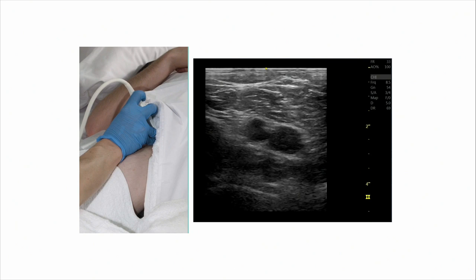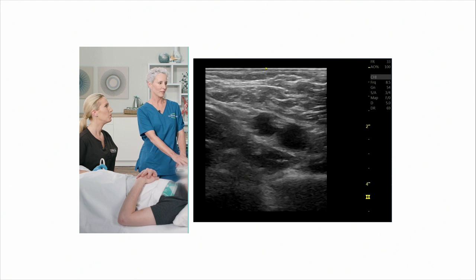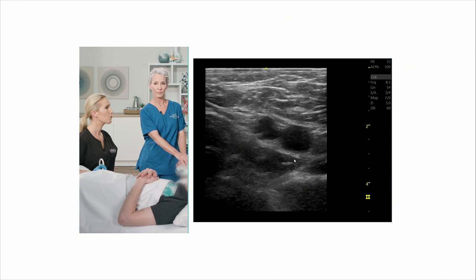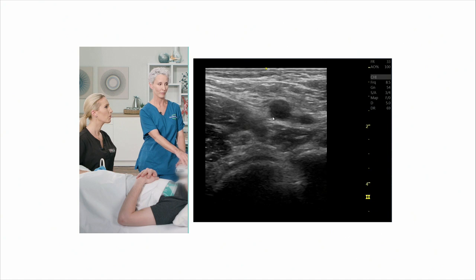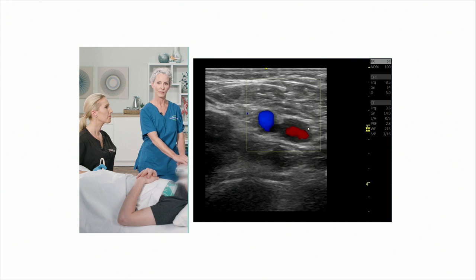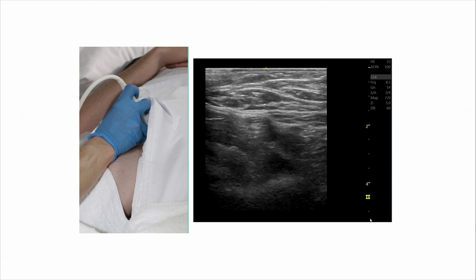With my indicator towards the right of the patient, I can clearly see two vessels: one appearing to be the artery and one the vein. Looking at the screen, we can see the pulsation of the artery on the left and no pulsation of the vessel on the right. Applying some pressure to the probe, you'll see the coaptation of the vein walls on the right, while the arterial walls remain open due to higher pressure.